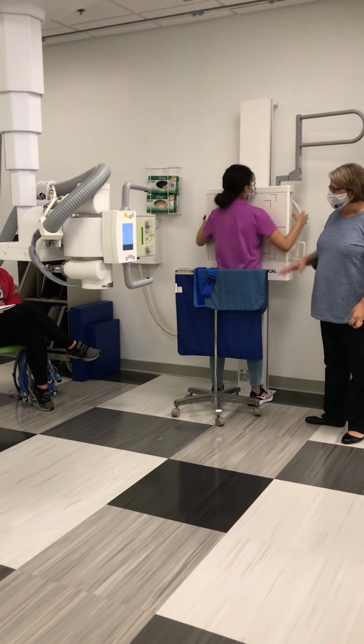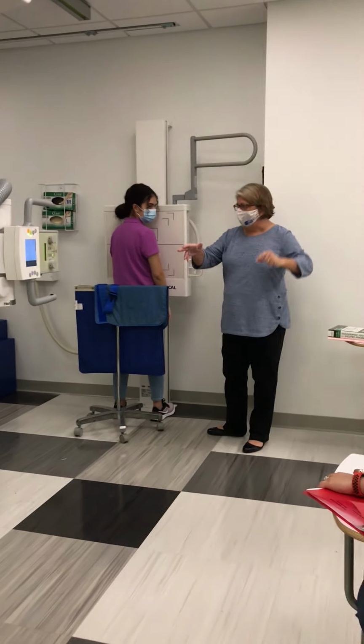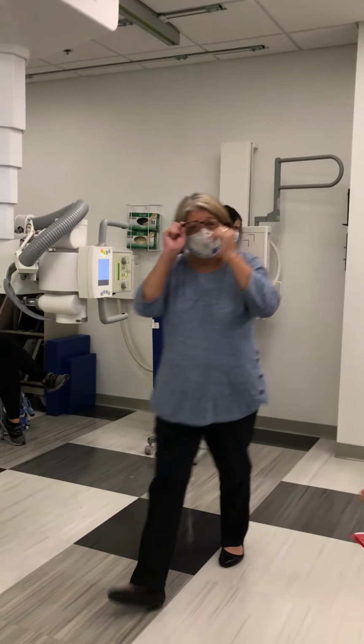You may relax. The reason I roll the shoulders forward is because you'll see on this image the outline of the scapula.